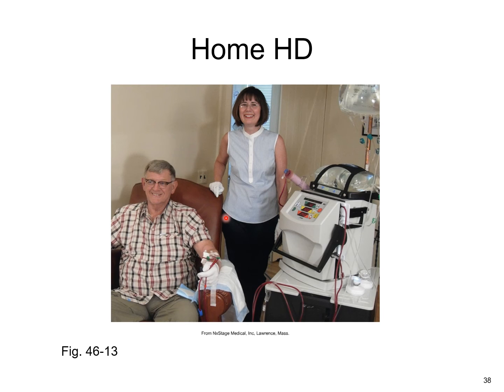So this is what home hemodialysis may look like. Think of all the things that I said that could potentially go wrong. So in order for home hemodialysis to definitely work, you need a supportive spouse for sure. My guess is that a lot of these people have somebody, maybe in the healthcare business, who is comfortable with all the machines and all the alarms that could potentially be going off. So a lot of confidence and a lot of skill is needed for the patient to be at home getting home hemodialysis.